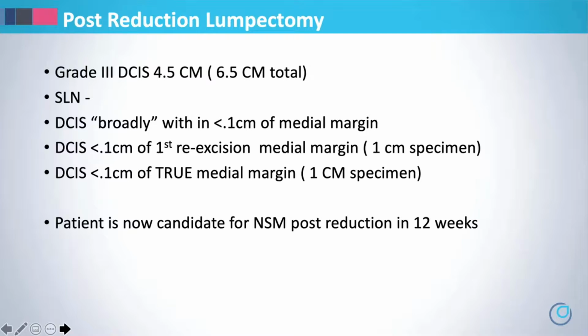So with no calcifications at the edge of the specimen radiograph as my only current usable intraoperative assessment, had I not had the OCT, she would not have been able to potentially avoid a third operation. And she's very happy with this. She was very happy. She participated in the trial. And this just speaks to the utility of OCT intraoperatively.